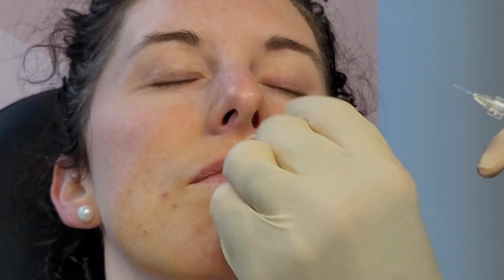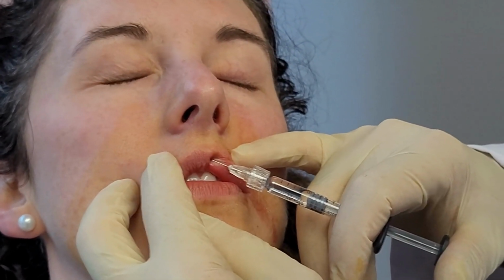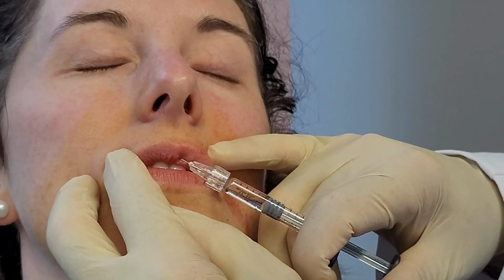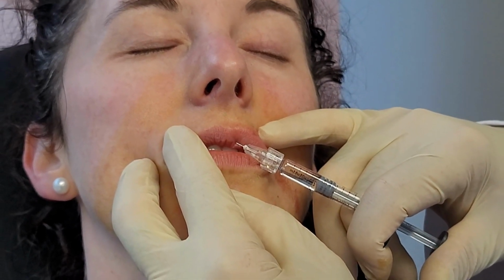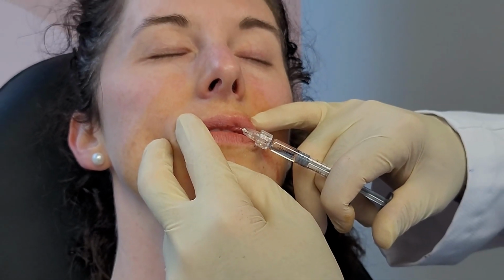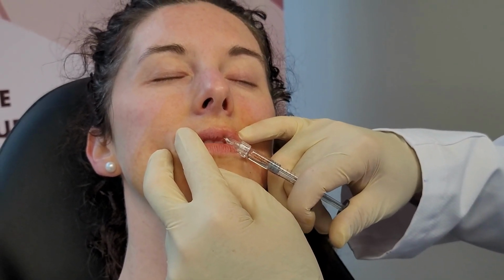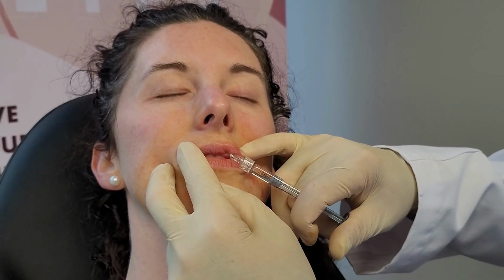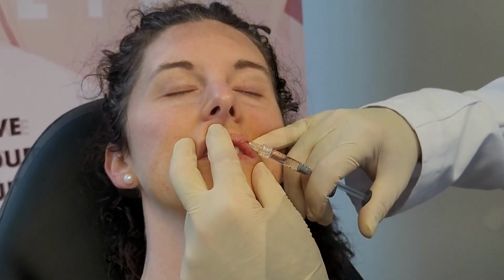Okay. Now, before I move on to the other side, I like to follow the contour. So I put my needle up like that, and I start filling this area from this side. And the lip fillers tend to be thick, so you have to push hard to go slowly. Now we're going to reverse directions.